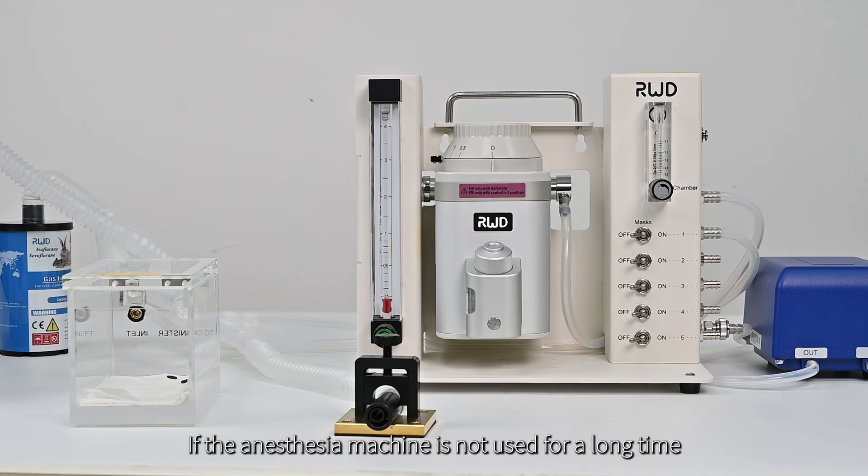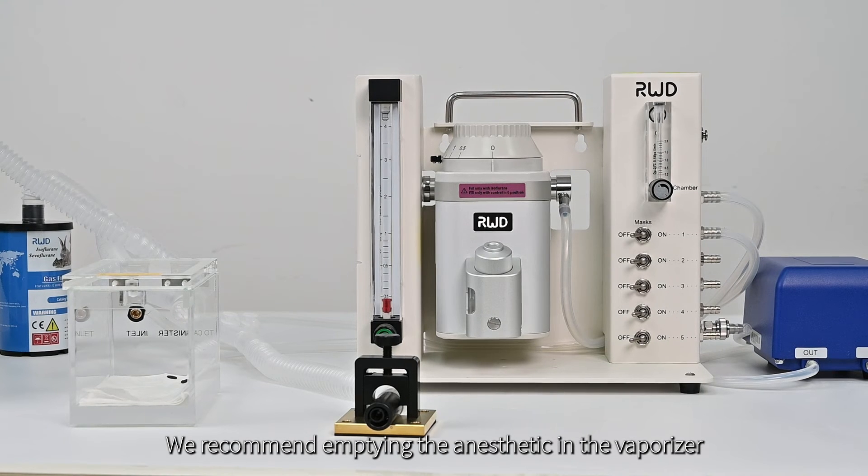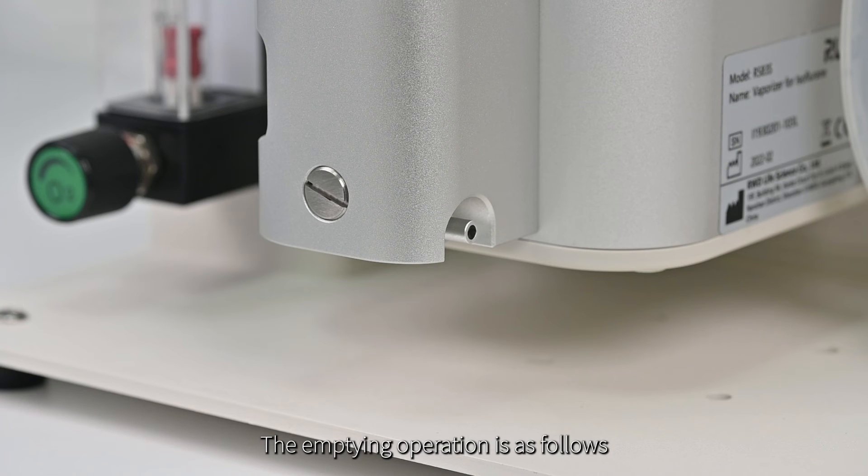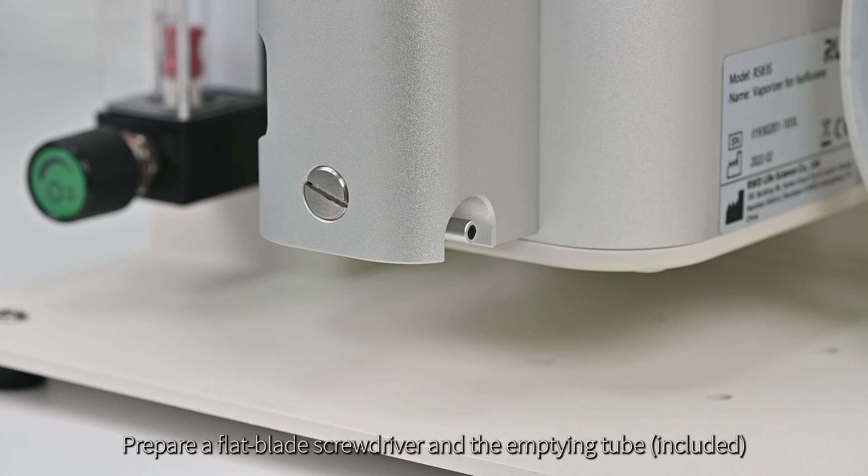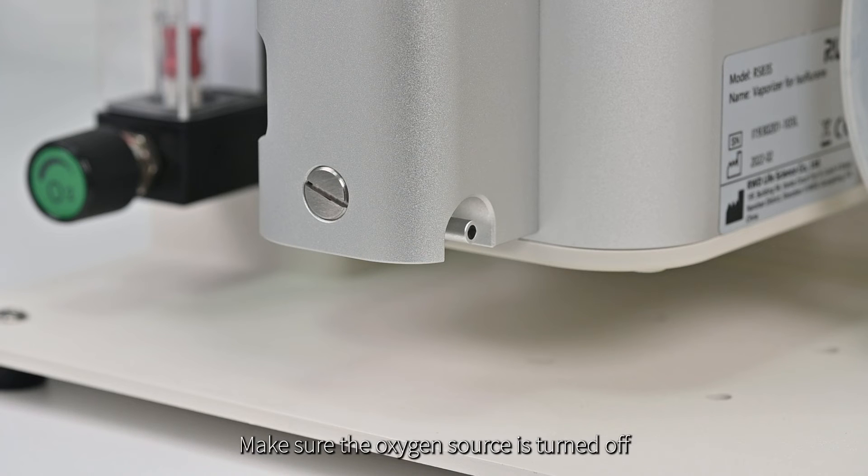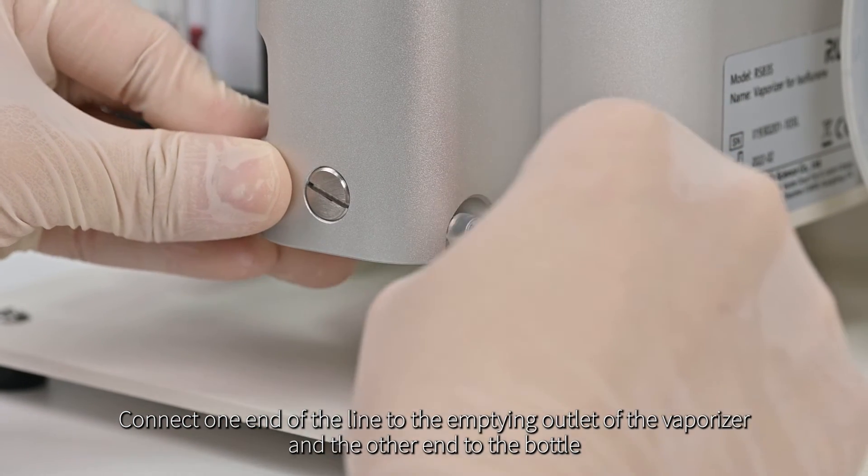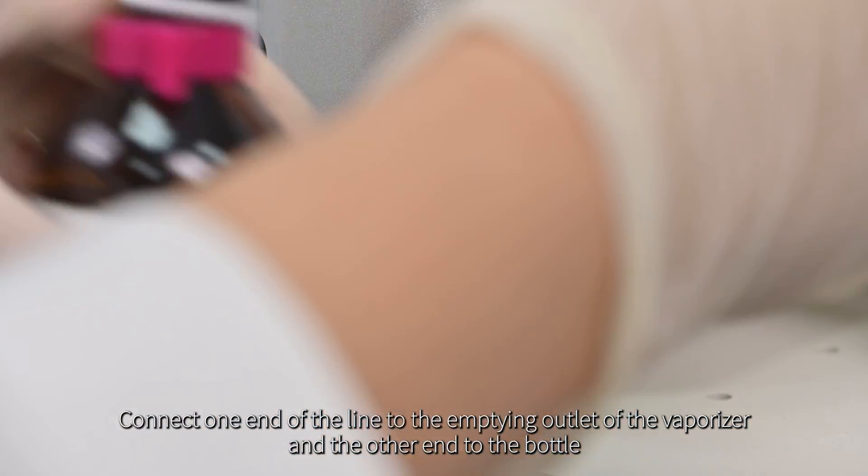If the anesthesia machine is not used for a long time, we recommend emptying the anesthetic in the vaporizer. The emptying operation is as follows. Prepare a flat blade screwdriver and the emptying tube. Make sure the oxygen source is turned off and the vaporizer dial is at the zero. Connect one end of the line to the emptying outlet of the vaporizer and the other end to the bottle.